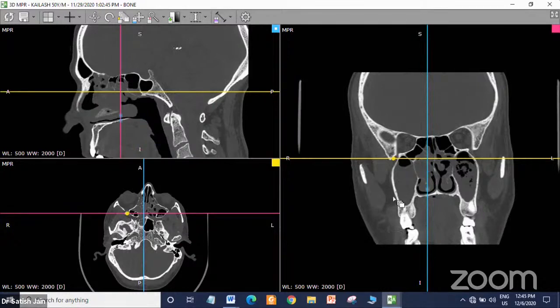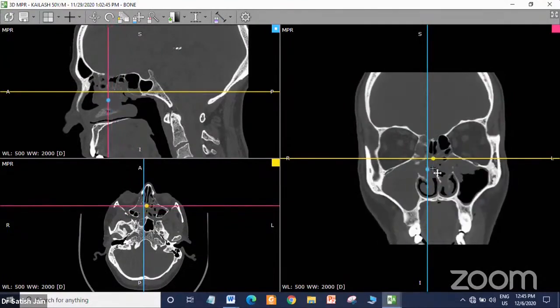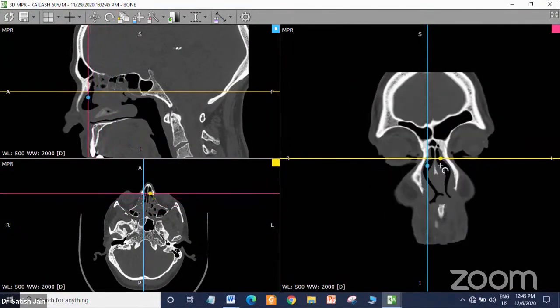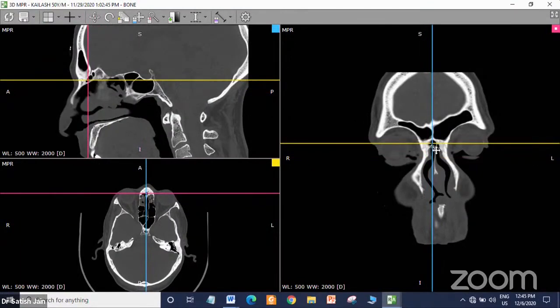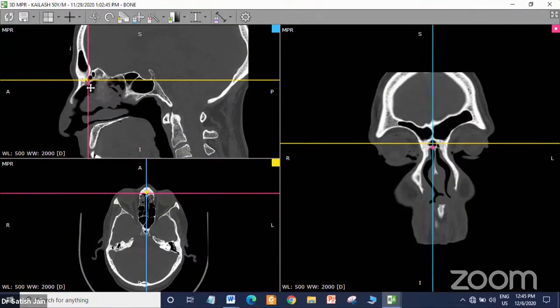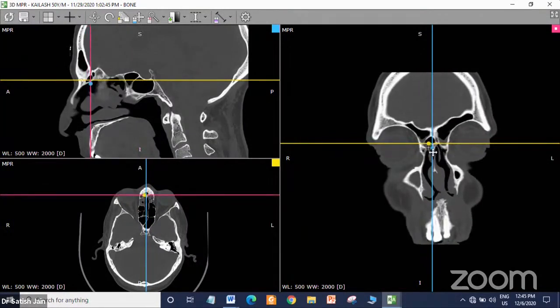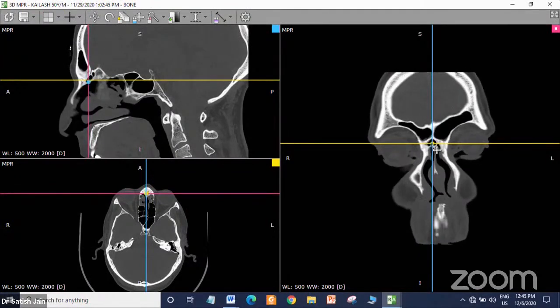So please go ahead. You get the dynamic information in all planes, and this is the best tool to learn the anatomy also. Suppose I want to see which cell this is. See this cell in axial. You can see in the coronal, you can see in the axial and the sagittal, two anterior cell, two anterior. It cannot be anything else than the intersinus septal cell. See that?